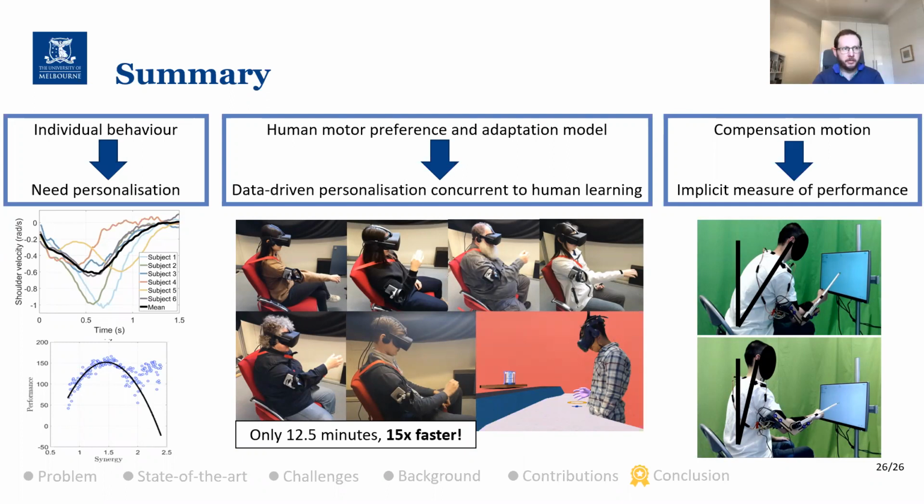So mainly for safety reasons, I guess. Yeah, so from a practical perspective. But if all these nonlinear behaviors that humans observe are addressed, and people have looked at how these synergies change over time, and it is a thing, right? As you learn a motor task, you change the way that you perform the task until you find that optimal, and that occurs over long periods of time. If you're playing soccer and you're learning to kick the ball, over many years it changes, right? So I would expect that this occurs with these systems.